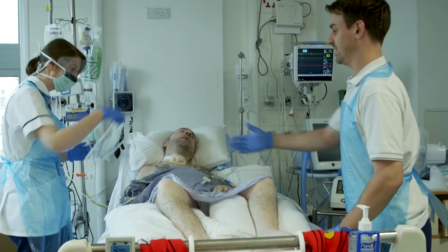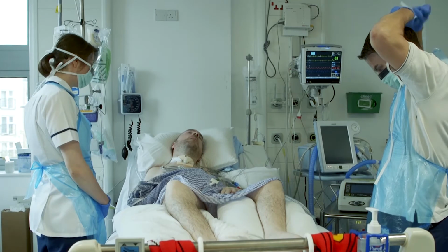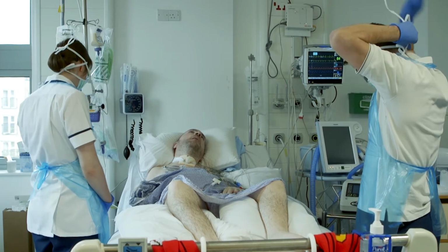The suction will be prepared prior to treatment. The therapists have put on their PPE or personal protective equipment in preparation for this treatment, including protection for the eyes and mouth due to the potential risk from spray and secretions.